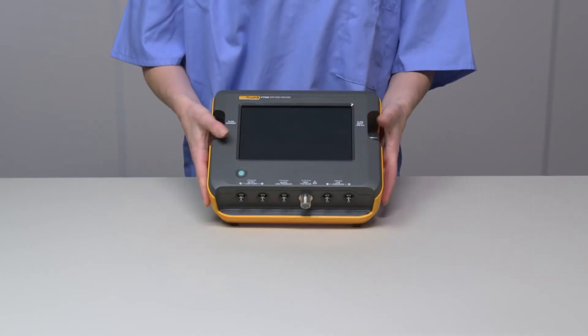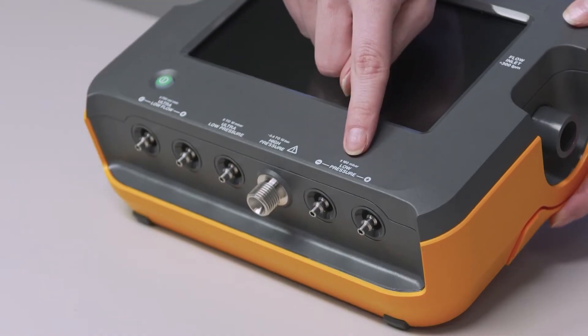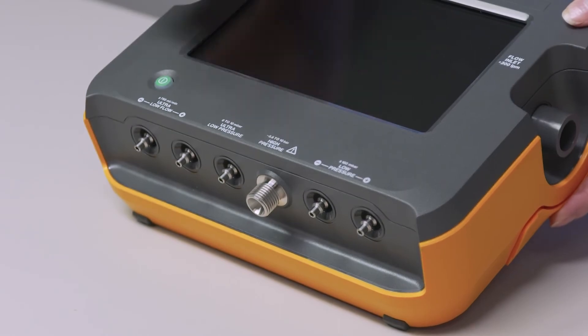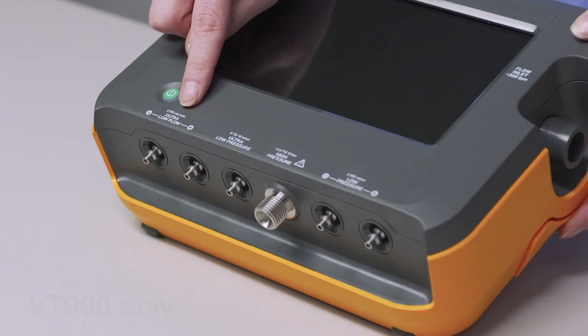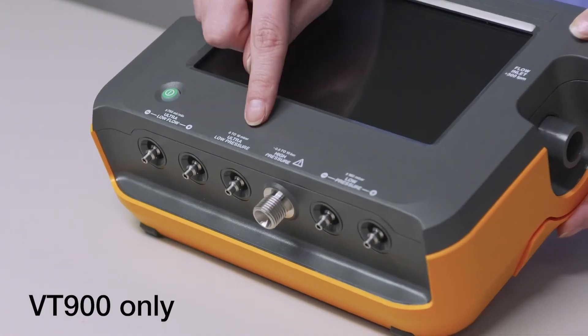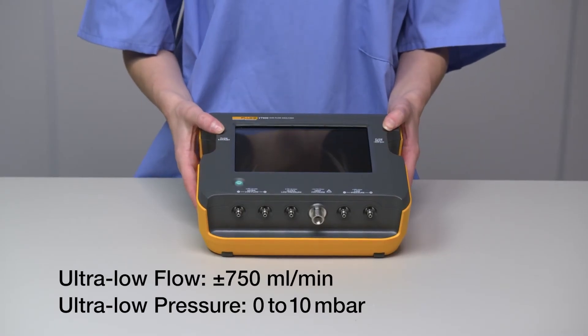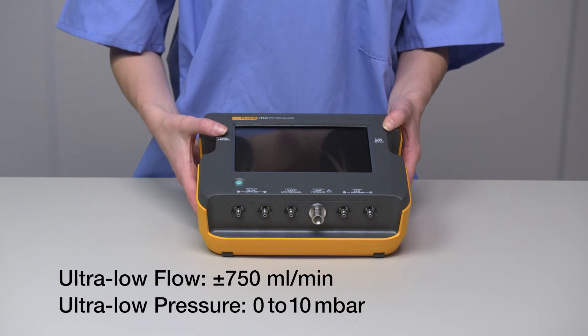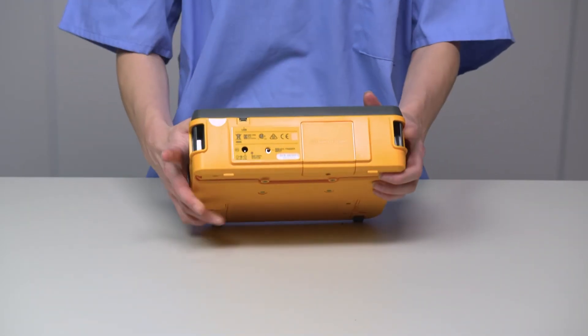On the bottom of the device, we have the low-pressure and differential pressure ports, and the high-pressure port. These are present in both the VT650 and VT900. The VT900 also features differential ultra-low flow and ultra-low pressure ports. These are for very low flow and pressure testing that require critical high accuracy and reliability in measurements, like anesthesia machines and multiple gas monitors.